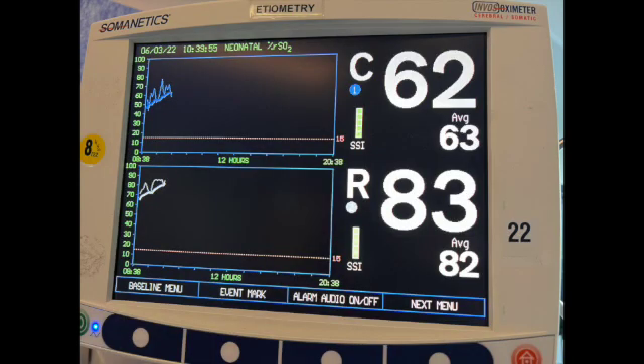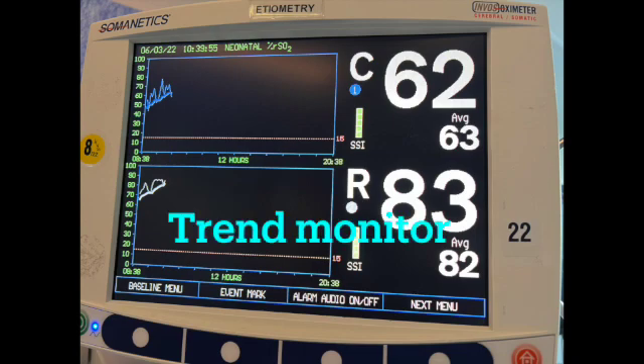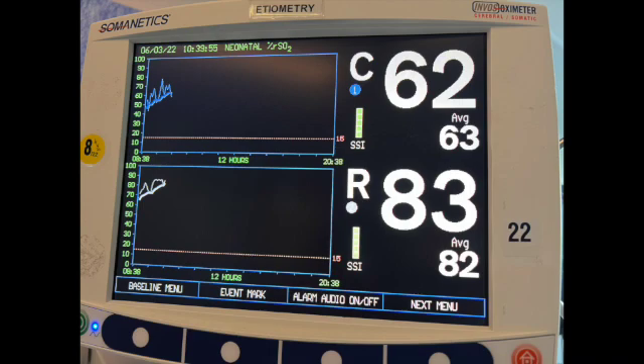Now let's look at some examples. This patient presented to the ICU two hours ago with a new diagnosis of myocarditis. We've been resuscitating with a little bit of fluid and inotropes. Is the resuscitation plan working? NIRS are often described as a trend monitor, and that's why the machines graph the values over time. While the absolute cerebral NIRS number of 62 is not exactly what I expect, the trend of both numbers is increasing, which is what I want to happen. I can look at this and decide my treatment plan is working.